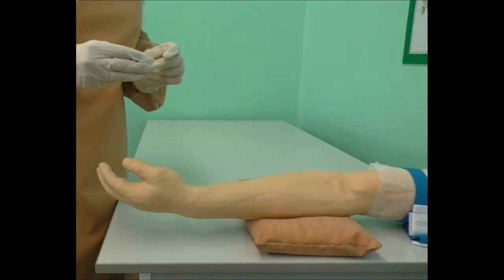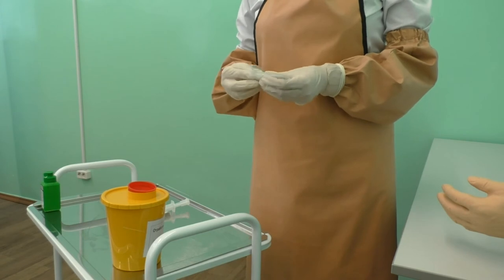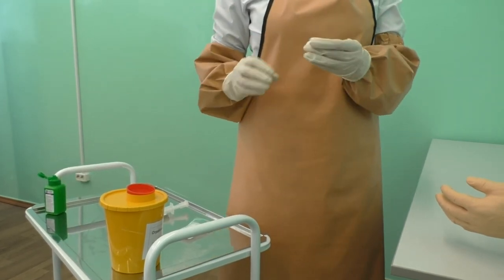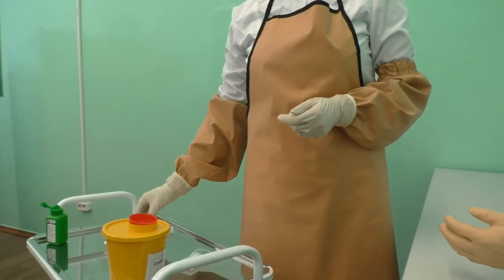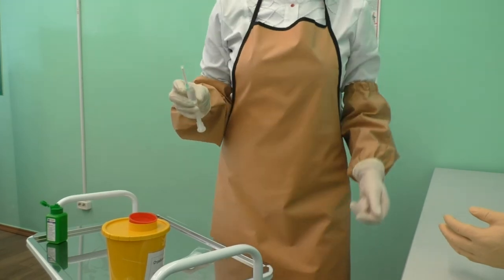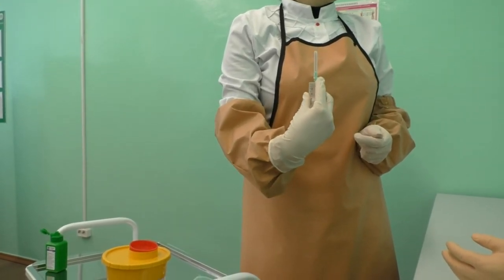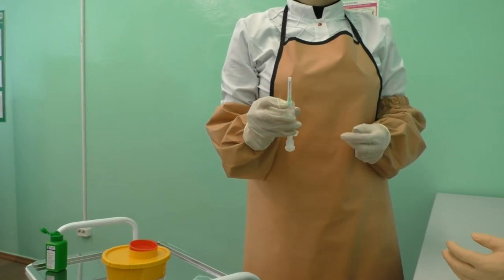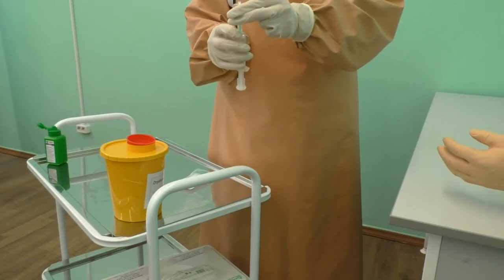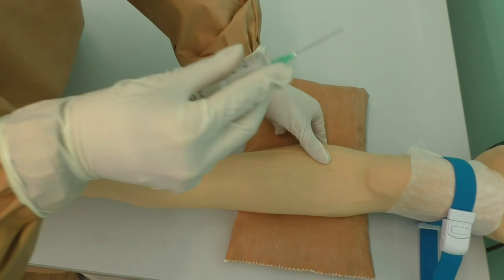Take the cotton ball with antiseptic in your right hand. Hold with your fourth and fifth fingers. Take the syringe from the package in your dominant hand. Place the second finger on the hub of the needle, with the other fingers on the syringe barrel. Remove the needle cap with your left hand and check the position of the needle. Fix the vein in the venipuncture area with the first finger of your non-dominant hand.